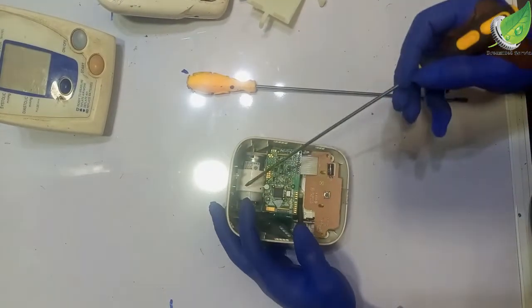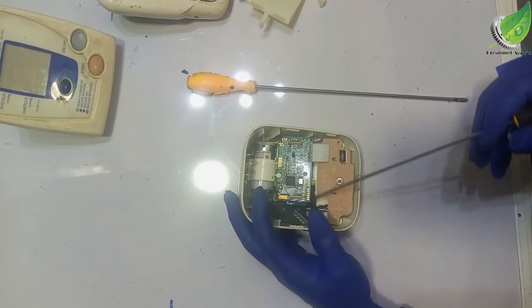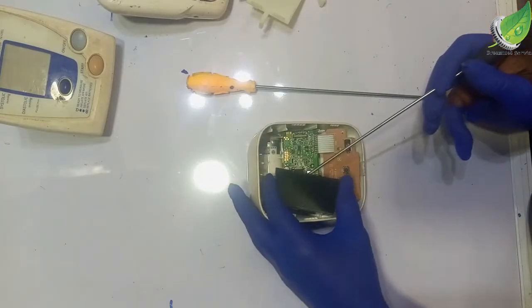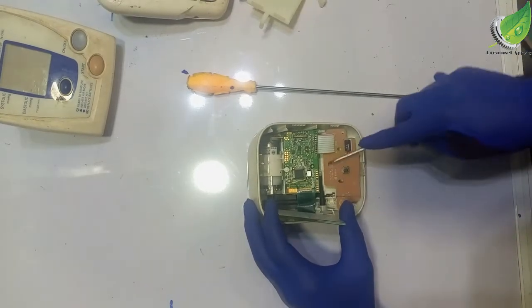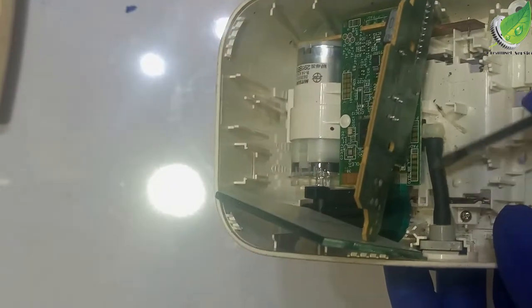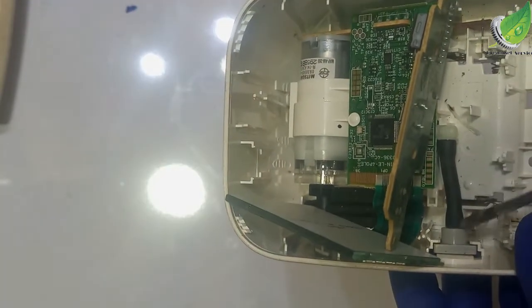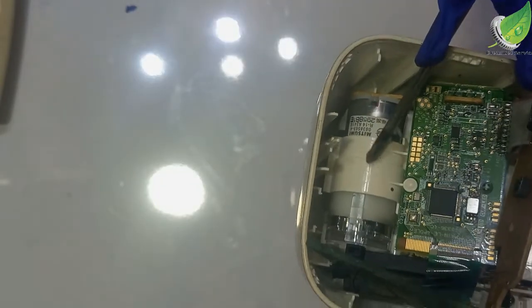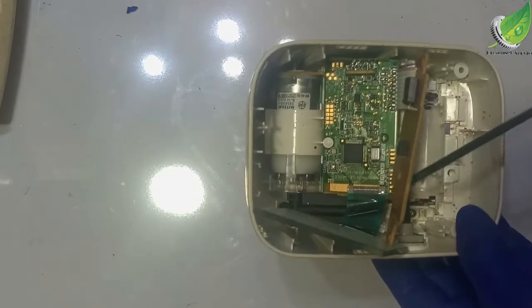So something is wrong between this pressure pump here and the valve that is letting the air out through this outlet. So let's solve the issue. We're going to inspect this valve here. This is a connection point that takes air from this pressure pump. So if your pressure pump is working fine and it makes a vibrating sound, and it's still giving you that error E1, that means air is escaping somewhere.